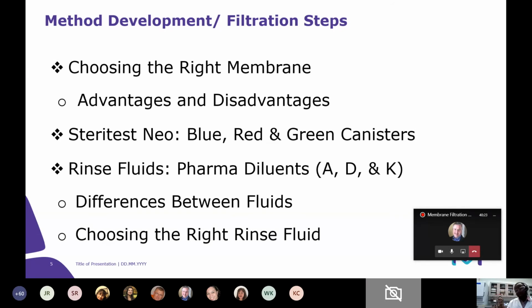If fluid K doesn't work, one of the options we have is IPM. It's the magic solution for most of the greasy stuff that people have challenges with. In my experience, it's always been an issue. And even when you get it, the other challenge mostly is, can you have it sterile? Because as we all know, in sterility testing, the less intrusion for your product, the better for you. People freak out even when you tell them to add. The more you add, the more manipulation, the higher the risk. So imagine having to use IPM that's not sterile. You have to sterilize it yourself, then use it. This is an added risk in the industry.